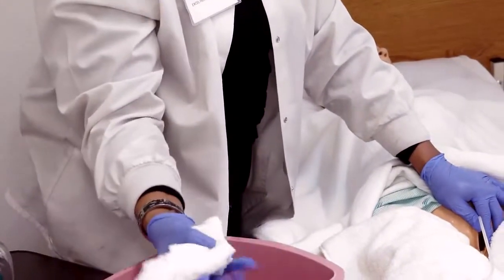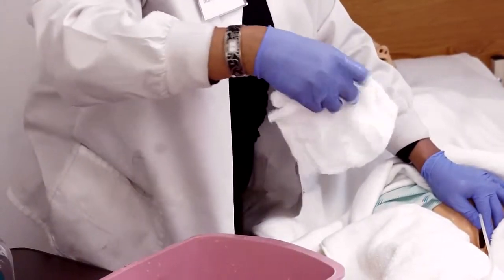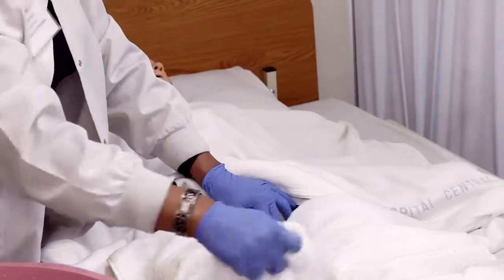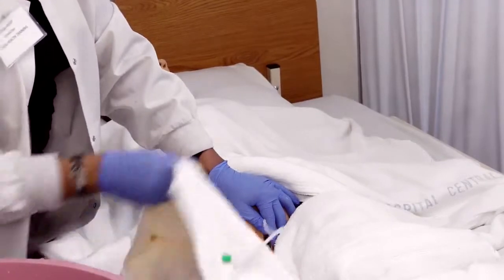Squeeze all the water out. Same process. We rinse 4 inches. We get a clean section without shaking. Rinse 4 inches. Put in dirty clothes. And now continuing to hold onto the catheter. Now we're going to dry 4 inches.